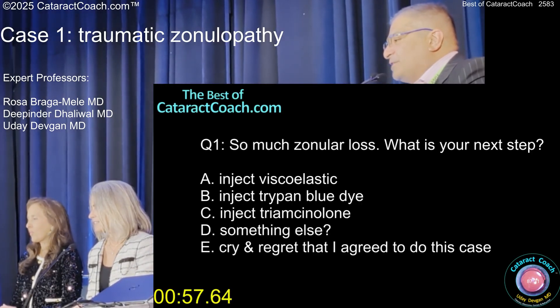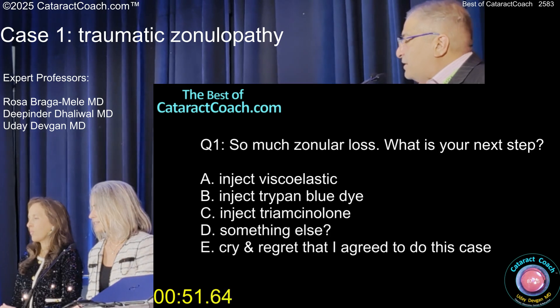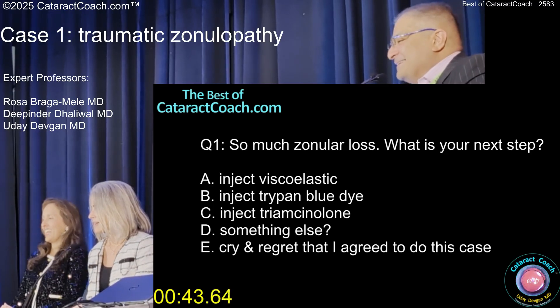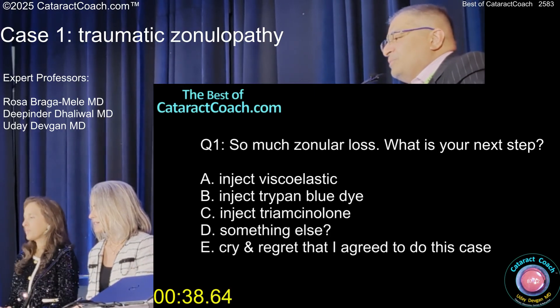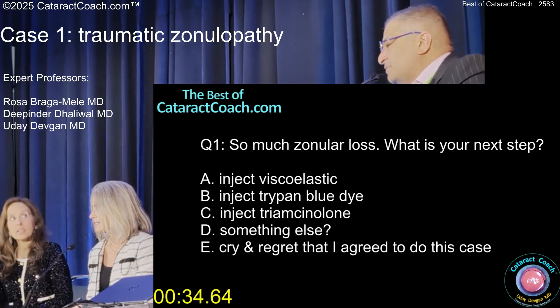What do you want to do? There's a lot of zonular loss. What's your next step? You're going to put in viscoelastic, inject trypan blue dye — do you want to inject triamcinolone, something else, or cry and regret that you agreed to do the case? What do you want to do in this case? Inject viscoelastic. It doesn't look like there's any vitreous.